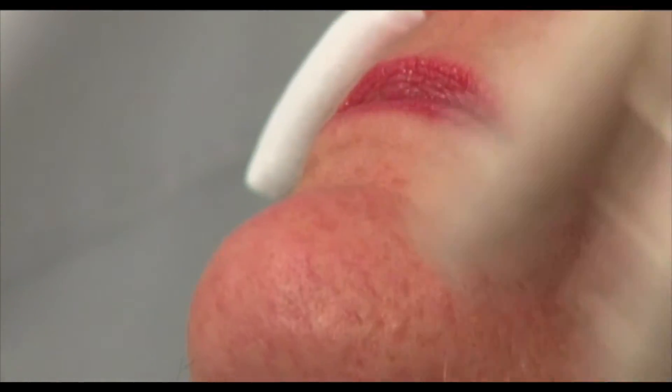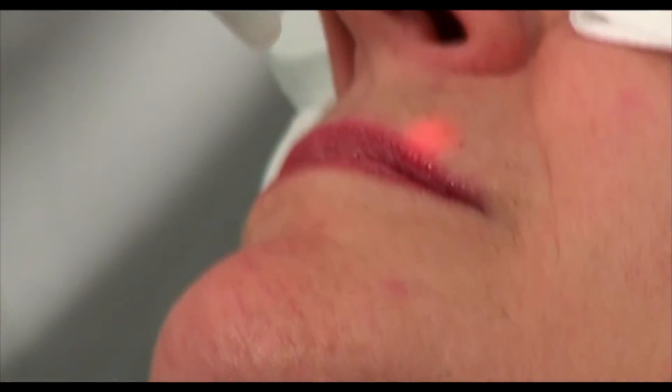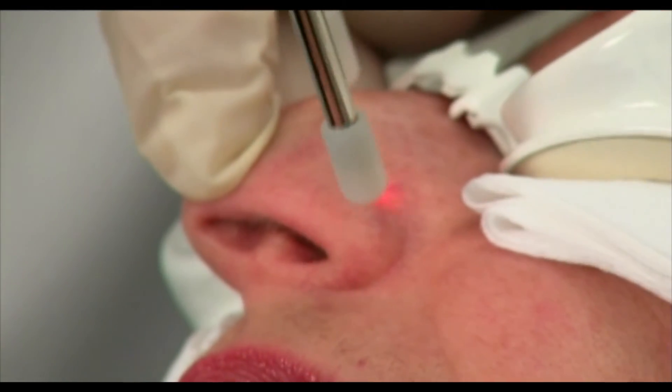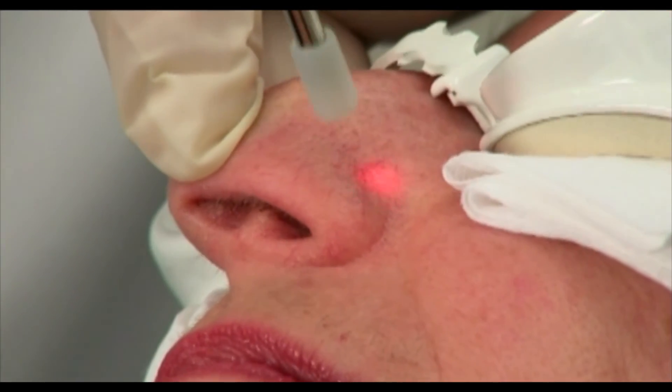Even looking at the vessels, I can see that they're blanched. I'll go to the side of the nose again — hovering on top of it, not overlapping at all.